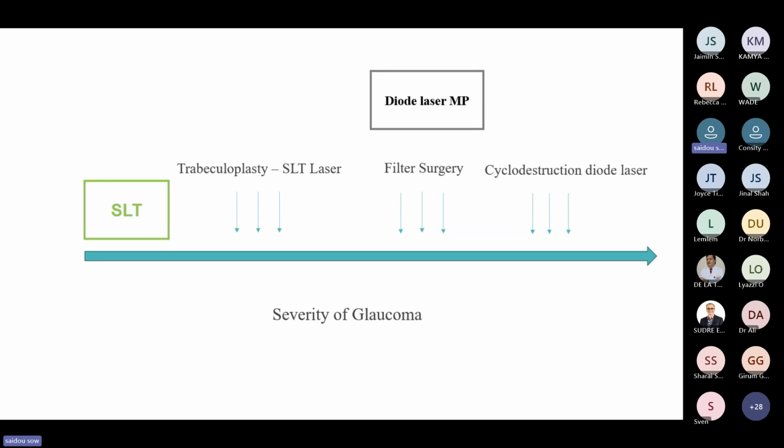see. It is a subliminal diode that Emmanuel has already introduced. This technique is better tolerated and we can propose laser in the evolution of the glaucomatous disease. In certain forms of glaucoma that we do not want to operate on, we can also propose diode laser. And also when there is a risk of complication if you operate on some types of glaucoma.